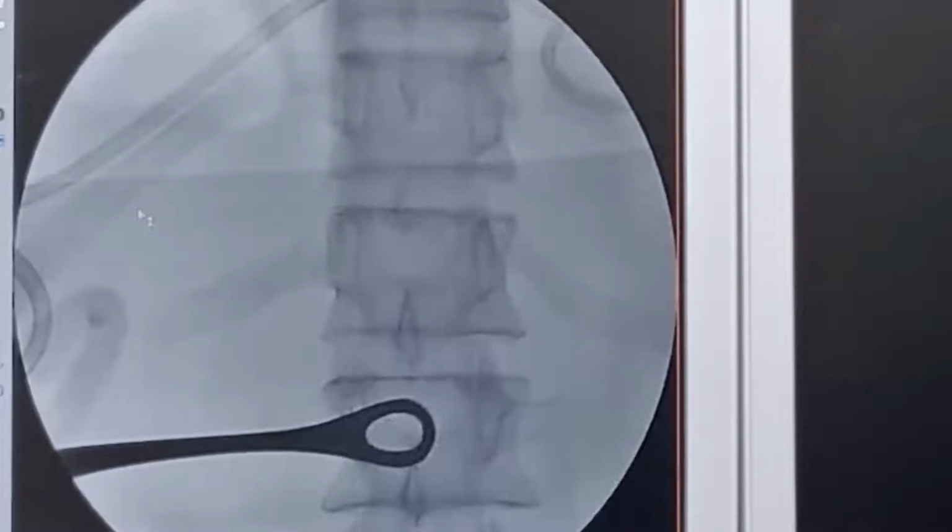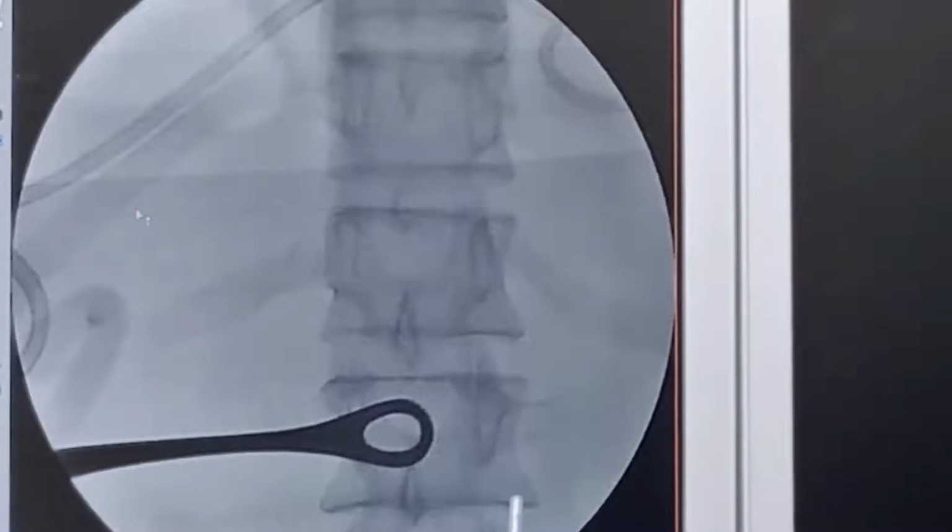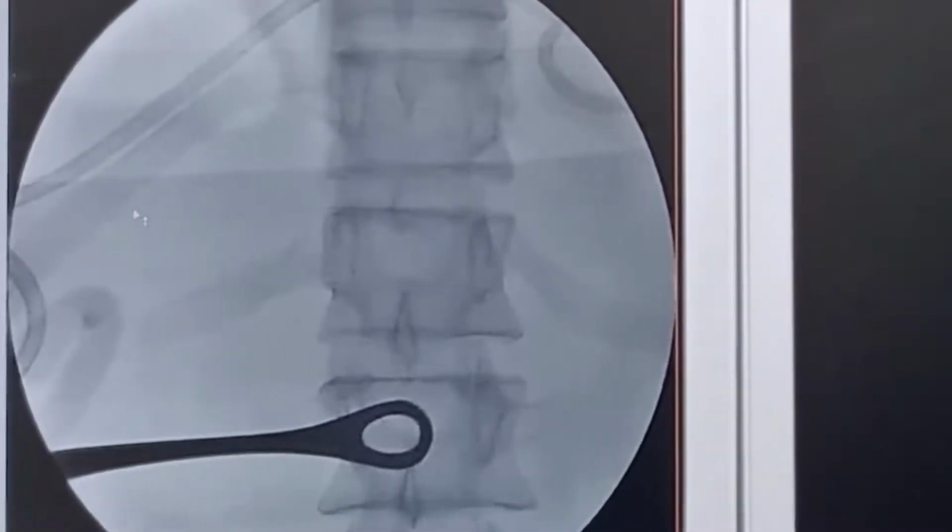The target L1 vertebra has superior endplate which is squared off along with the inferior endplate which is also squared. So you can only see one single black line rather than a hollow of the line which usually comes like this. So it needs to be squared off before starting the procedure.